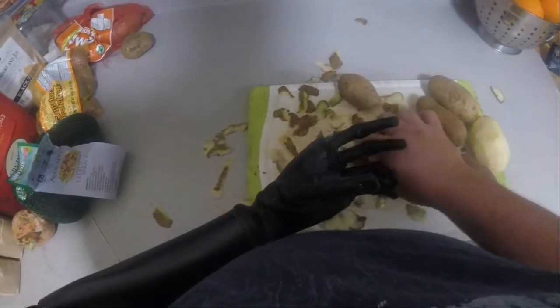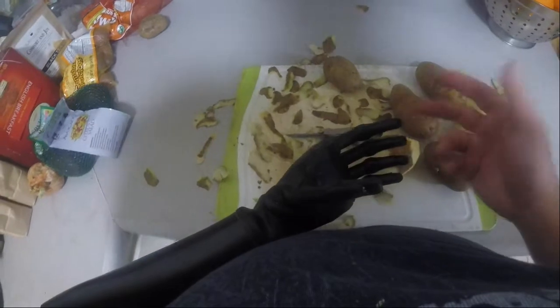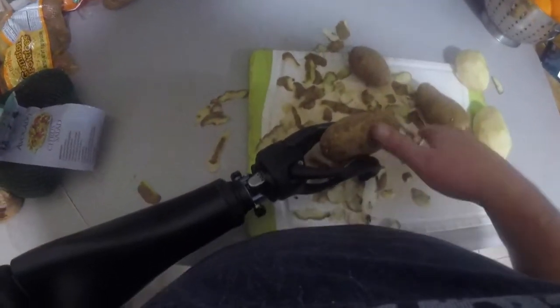Right here I'm having some difficulty with my i-limb hand — it's getting a little bit too slippery with peeling the potatoes — so I've opted to switch to what's called an ETD, or electric hook, so you get to watch that a little bit.